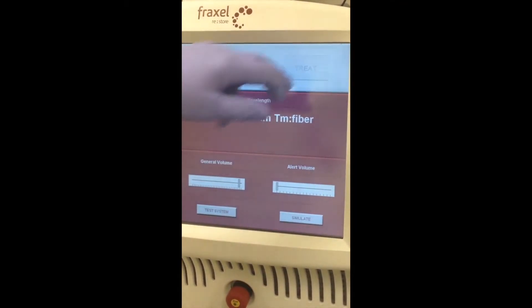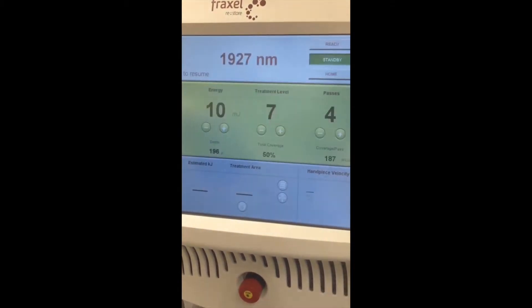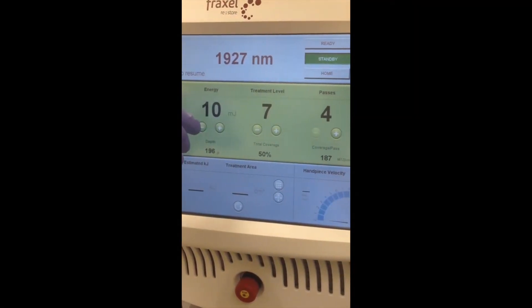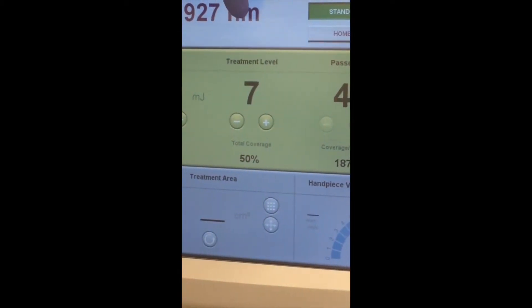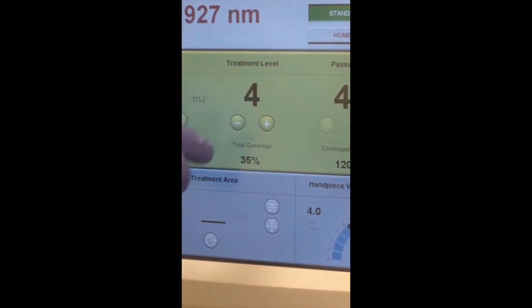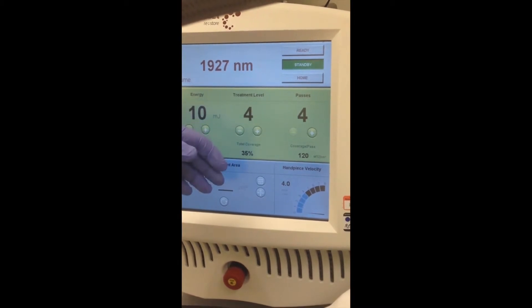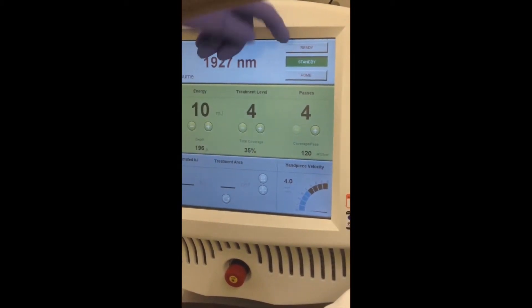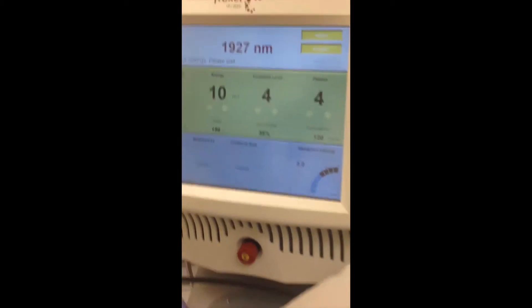Changing now to 1927. The plan is to go with 10 millijoules, which gets about the same depth as 20 millijoules. I'm going to give less than 50% total density — we gave 11% before, so I'm going to give 35% density, which gives a total of 46% over four passes. Force cold air on, off we go.